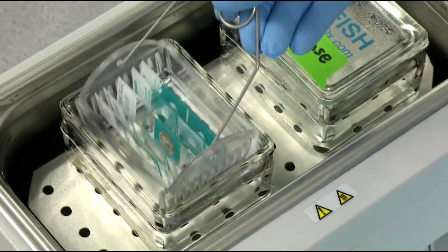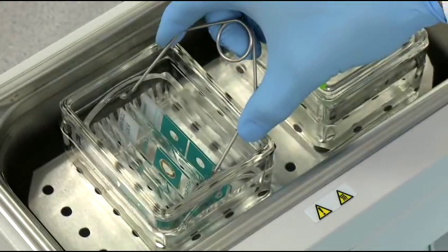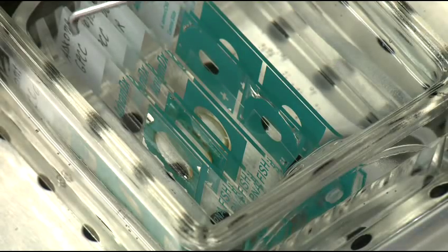After hybridization, place slides in slide rack, immerse in wash solution and gently remove cover slips.